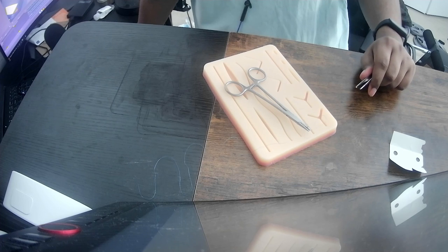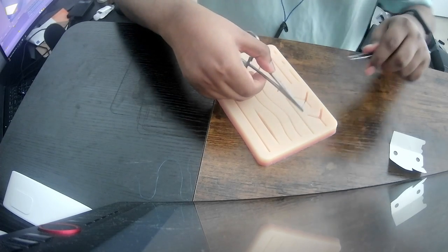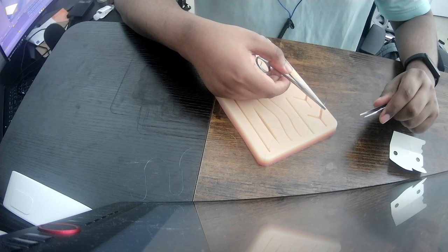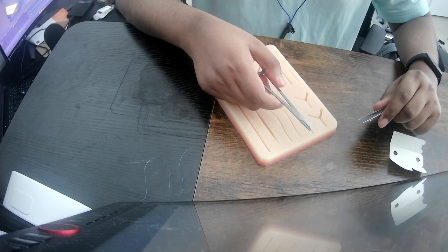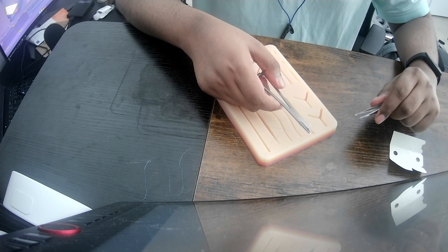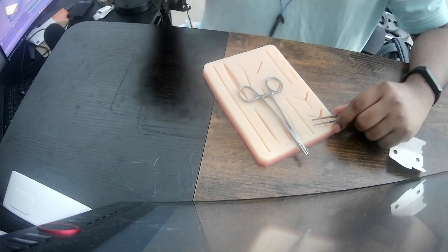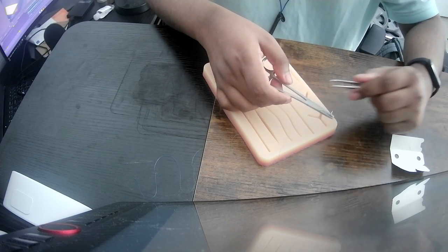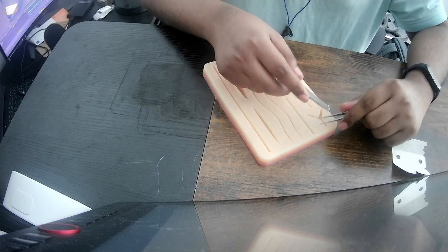And this is really what you need the most practice doing: unlocking, locking, getting tangled with your suture, reloading things as you go through the skin and pulling it through. And again, it's not going to be pretty every single time, and it's not going to necessarily be perfect, but you can practice doing these steps over and over again, with something that's sterile, with something that's cheap. Okay. So for today, I won't drag on for too long. I won't do the simple interrupted sutures just yet, maybe tomorrow. But let me just practice a bit more, this driving muscle memory thing.